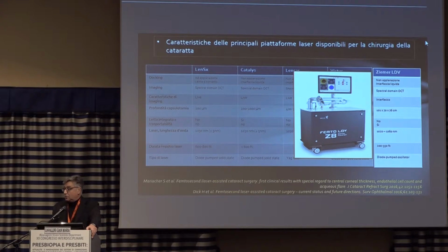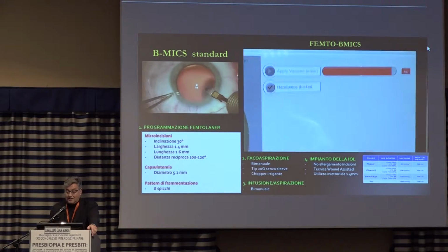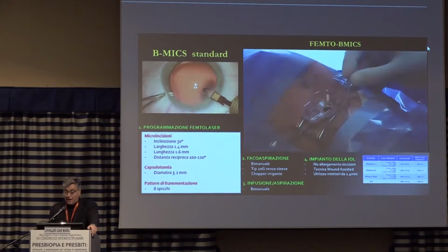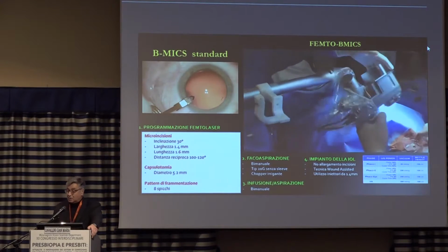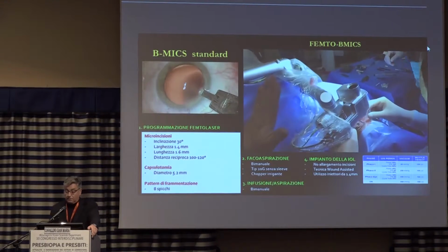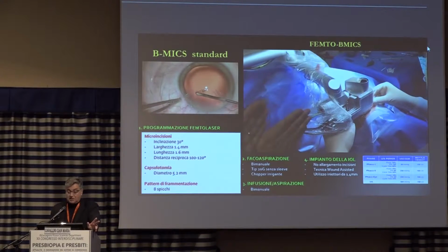This is the laser I use in Modena, thanks to a university donation. I will have it available for 3 years. It's wheeled. It can be taken to one place or the other. You don't really have to move patients, as in the case of other laser machines. On the right, you see that we have applied the tray that we fill with water because there is a liquid interface. Then what we do is position the laser tube for docking purposes.